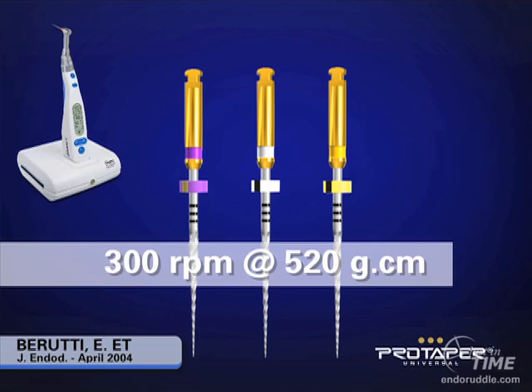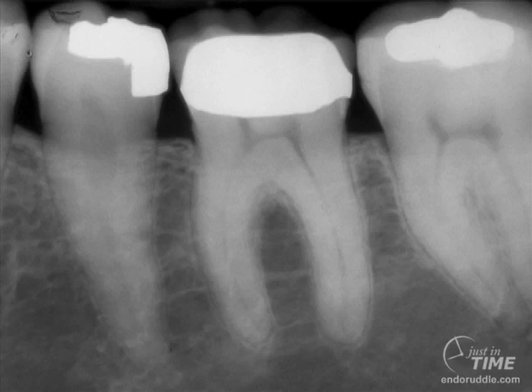The final analysis in that article, and this was something that was discovered during the actual creation of the instruments, and it was verified and validated by engineering reports, is that 520 is the proper high torque that's required to effectively use ProTaper instruments.